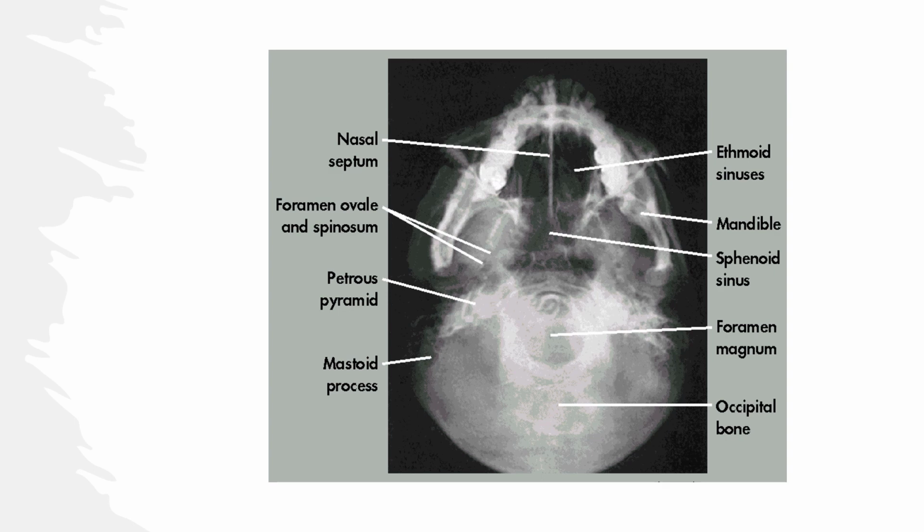It's either done standing or sitting. It is really difficult to do supine. You're going to have to build the patient up on a sheet of foam and then have their head hang off the edge of the table or something. That would be the only way to do it supine. And then support the image receptor with a chair and a foam block or something like that. That's the only way to do it with the patient lying down. Standing up, you need a flip-top head. Now, where do you center? You can kind of figure it out.